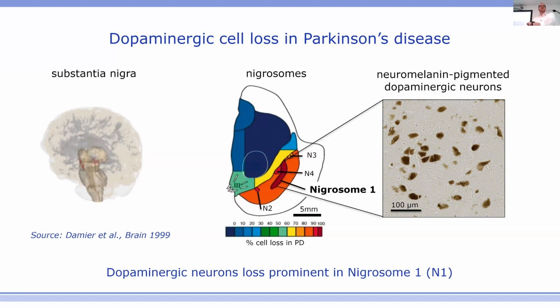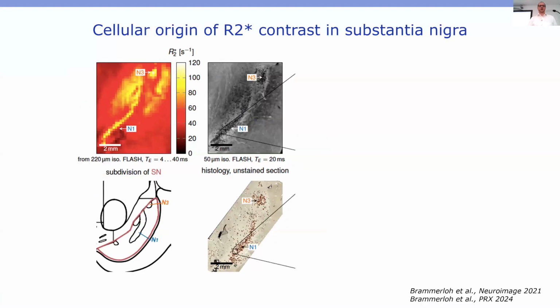Can we get information from MRI about these cells? And indeed, you can. First of all, post-mortem, you can acquire very high resolution MR data, so you start seeing actual single cells. When you compare the microscope image, the histology, with the MR image, it looks very similar. You can start seeing single cells at about 50 to 20 micrometer resolution.